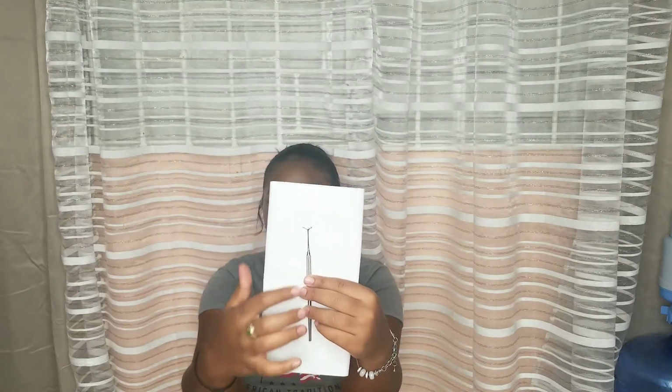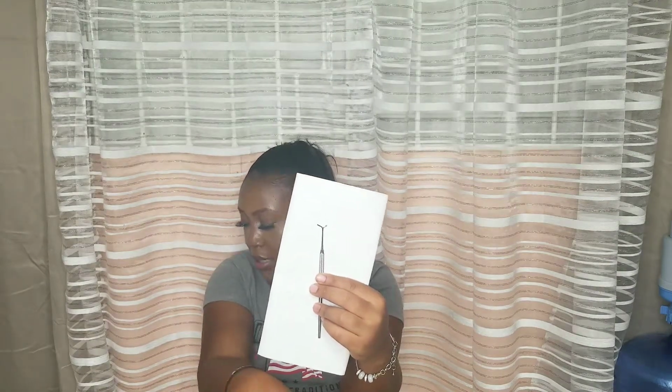You have a T-ball burnisher. It looks like a T and has a ball at one end, so that's why it's called a T-ball burnisher. That's all I can find right now in terms of burnishers, but basically all the burnishers do the same thing. They shine your cavity preparation, your amalgam filling, to make it shiny, nice and presentable. Because they have different shapes, you use different ones for different purposes, which you will understand once you start dental school.